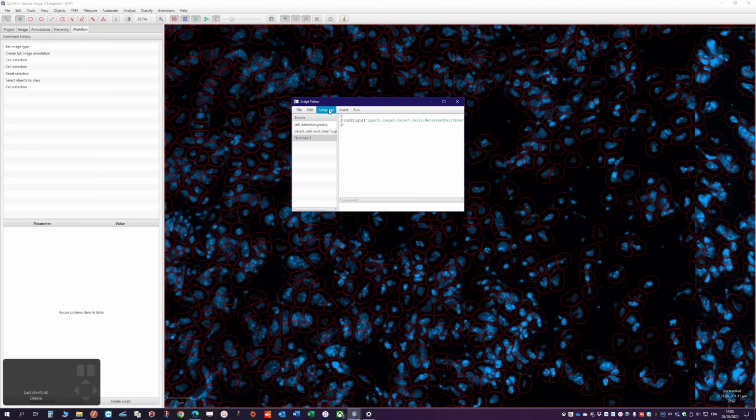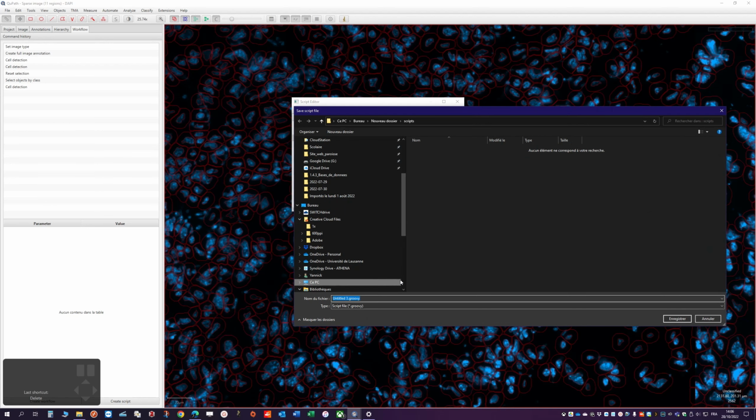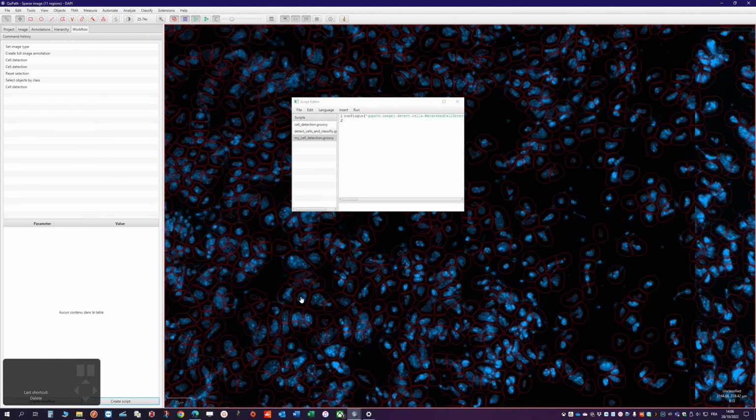Get rid of everything else here, and as you can see, I already have some other scripts, but let's ignore them for the moment, and let's save this as my cell detection, like that.